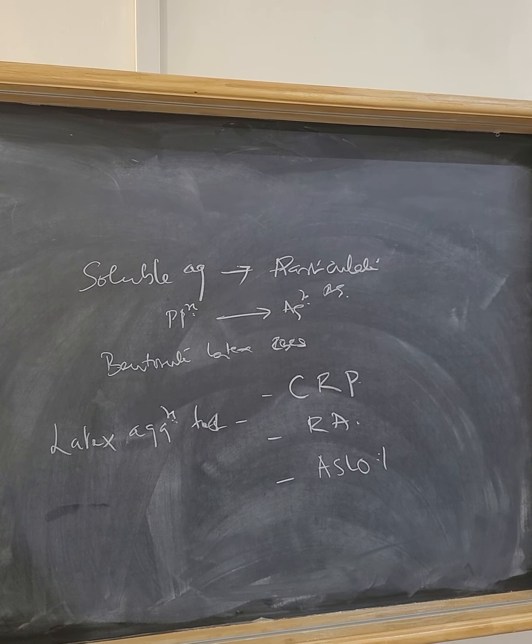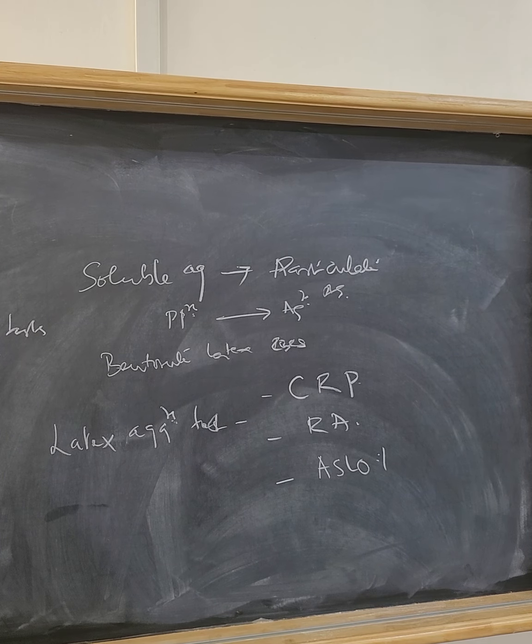These are also called passive agglutination tests.